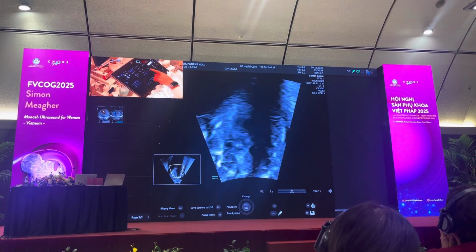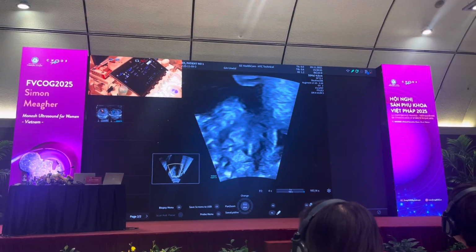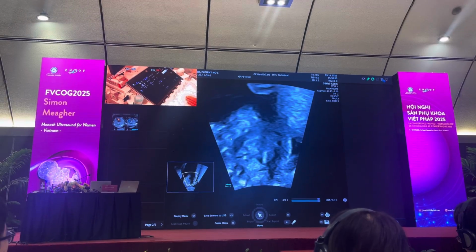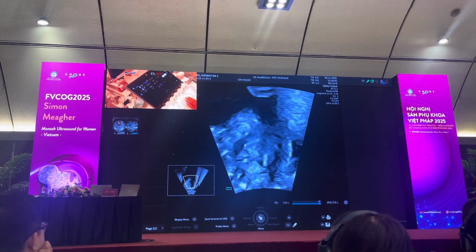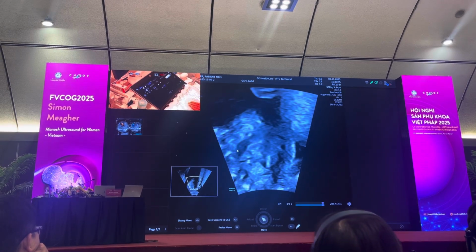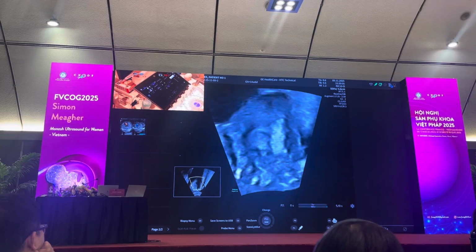And then when you've got zoomed in on the heart, hit a button on the lens, which just gives it more penetration. And now I can see the pulmonary valve. So this is the dilated duct, because the baby's got aortic atresia. And when you've got aortic atresia and left ventricular atresia, the pulmonary artery is enlarged. So you've got dilatation of the arterial duct, and this is the pulmonary valve.